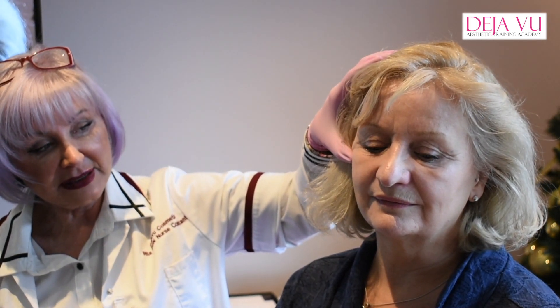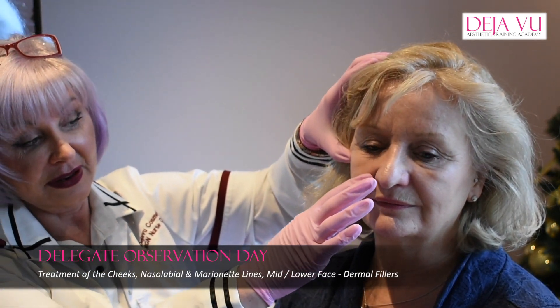We've already done cheeks today, but if I had Sue as one of my clients and she says it's dropping down here, obviously you can fill these out to make it look less, but one of the best things to do when you think about it is we just start lifting from here. So you lift from here, that means then you don't need so much filler here and here.